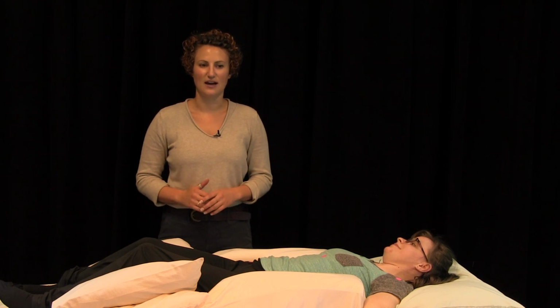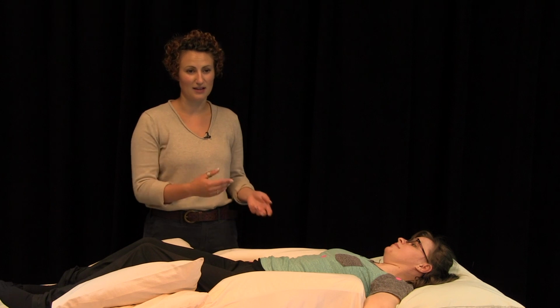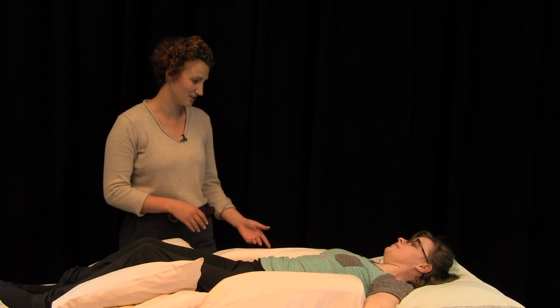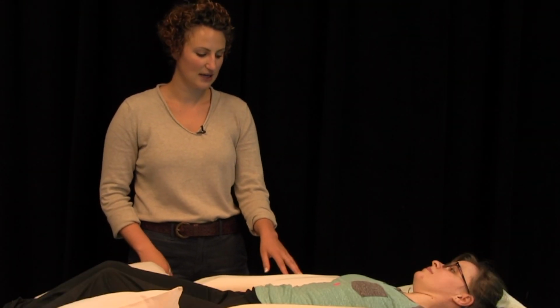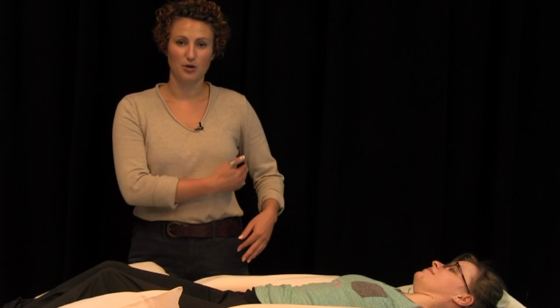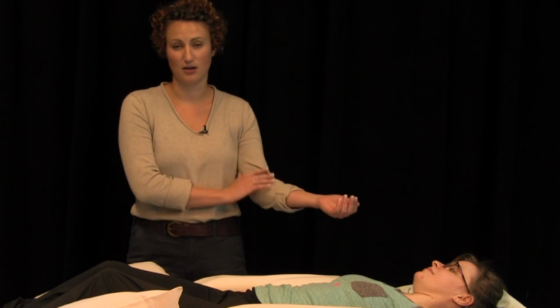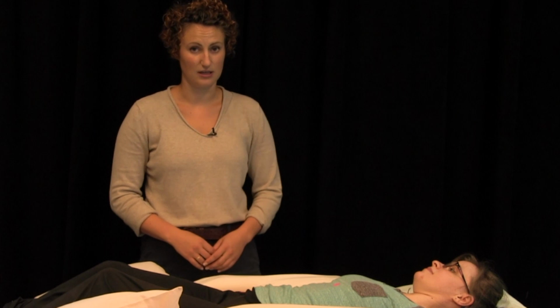Check in with the user after each tug of the sheets to determine if they are comfortable. You may need to go back and forth, tugging gently on the sheets to both straighten the chest and ensure the user's comfort. When placing these lateral supports, it is important that there is an extra layer of cushioning over them, as there are bony prominences along the chest, on the rib cage, and on the arm, and this will help prevent pressure injuries in those areas.